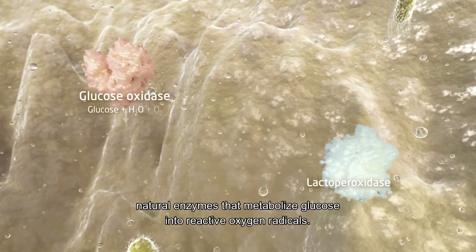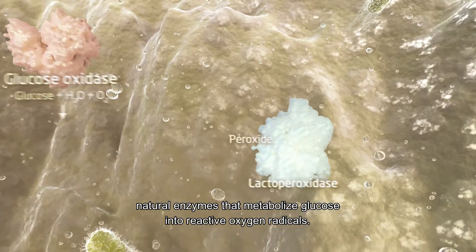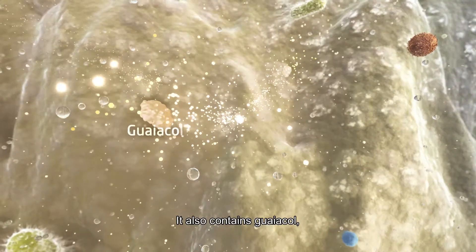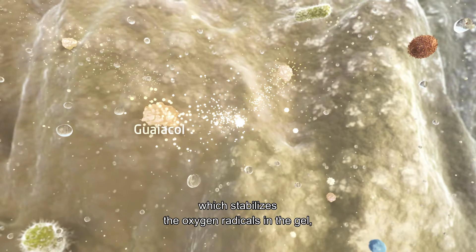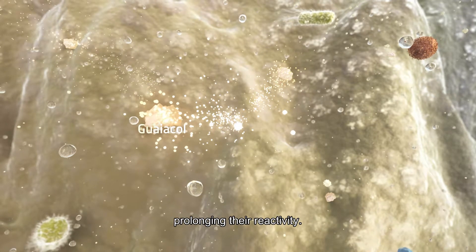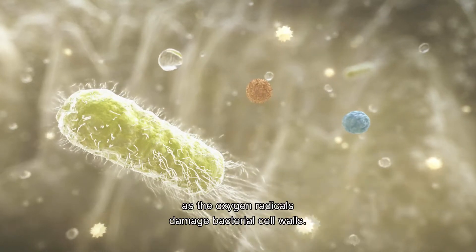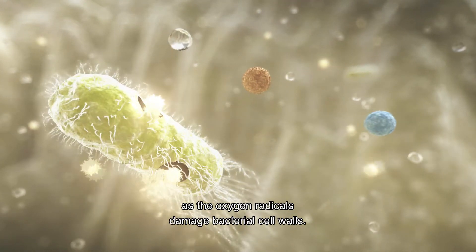natural enzymes that metabolize glucose into reactive oxygen radicals. It also contains guaiacol, which stabilizes the oxygen radicals in the gel, prolonging their reactivity. Bacteria in the gel are eliminated as the oxygen radicals damage bacterial cell walls.